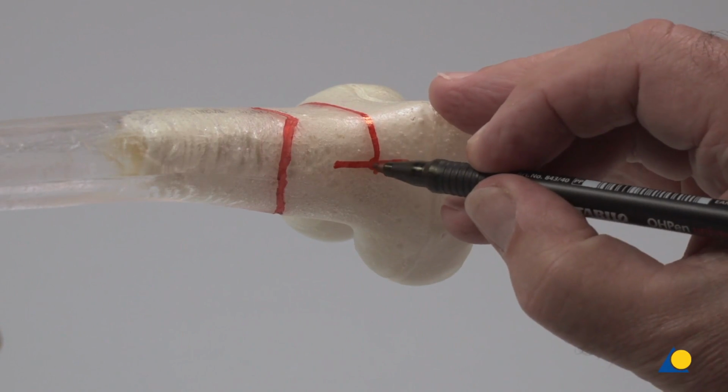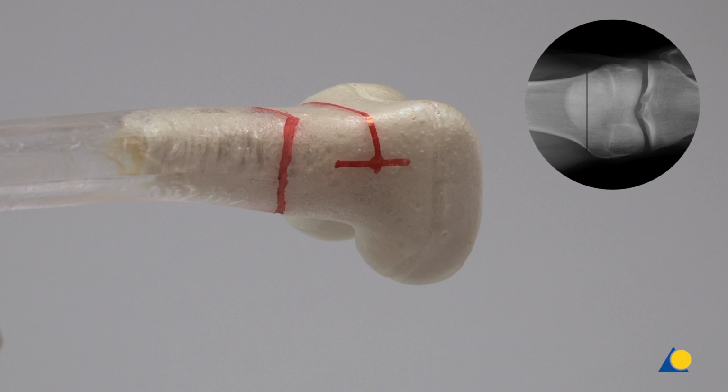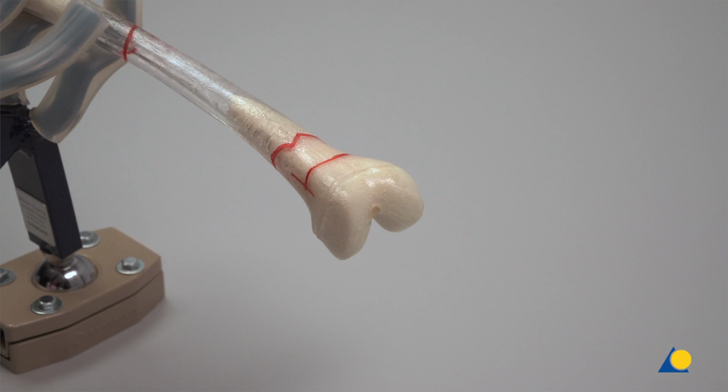In order to achieve optimal symmetrical bracing, it is crucial that the entry points are precisely matched on both sides of the medullary canal. Clinically, the intended insertion points must be verified under image intensification. As the bone model has a hard cortex structure, there is a high risk of slipping off the surface of the cortex, causing personal injury. Care must be taken when creating the opening.